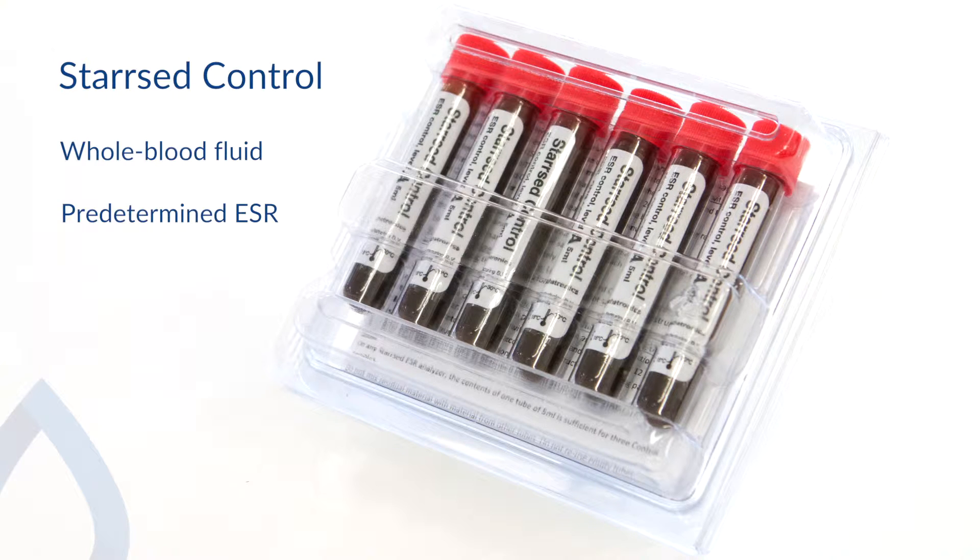Starrsed Control is to be used in the RR Mechatronics ESR analysers as if it were a real patient sample, and is fully compliant with the ICSH recommendations and CLSI procedures.